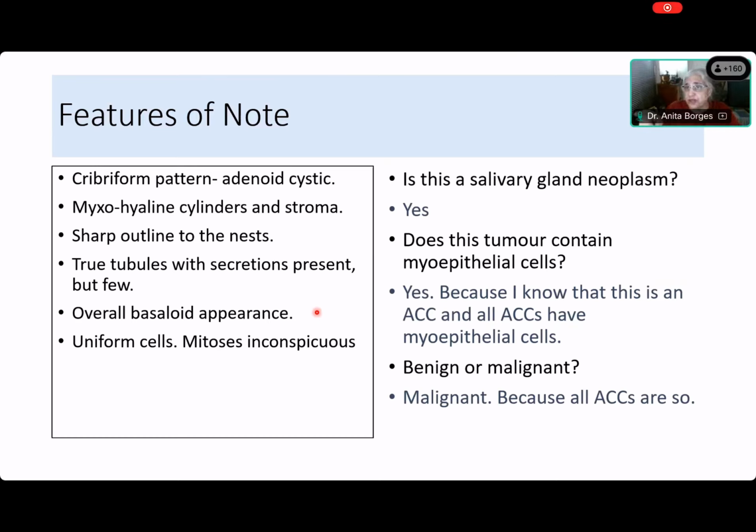And you should have learned something today, Somik. And what is it that you have learned and others have learned as well? That all carcinomas do not show you pleomorphism, do not show you mitoses, can have a uniform appearance, and still they are carcinomas. Why are they carcinomas, Somik? Because they behave like carcinomas. Everything that looks like this and is an adenoid cystic carcinoma is malignant. That's why we call it a carcinoma.